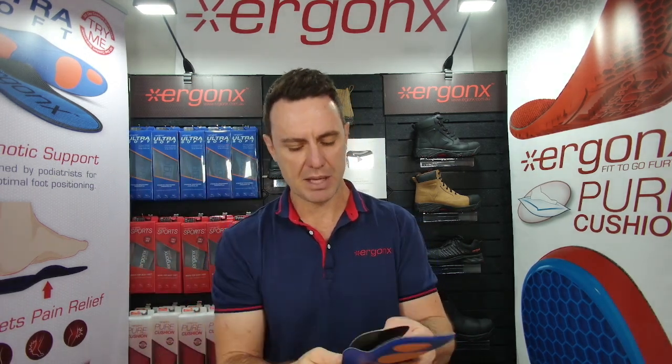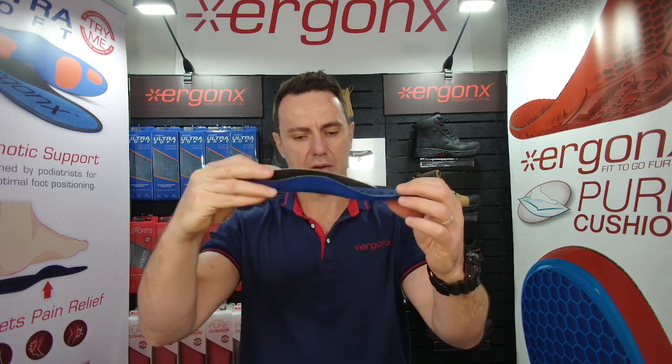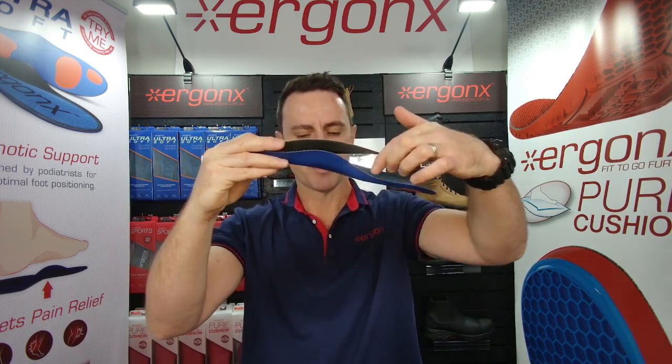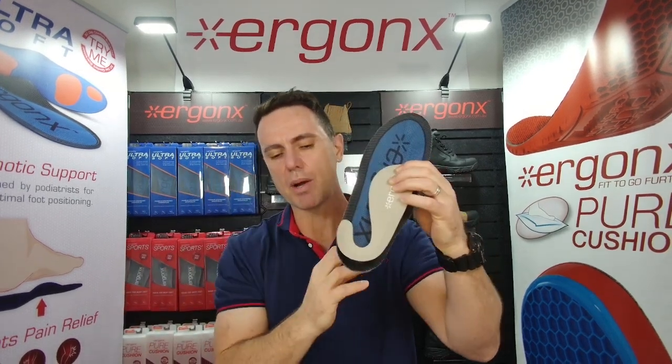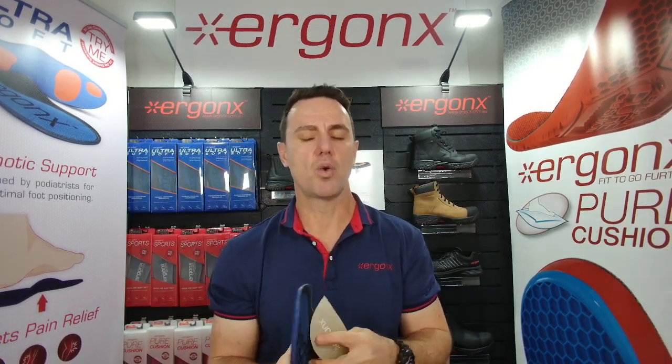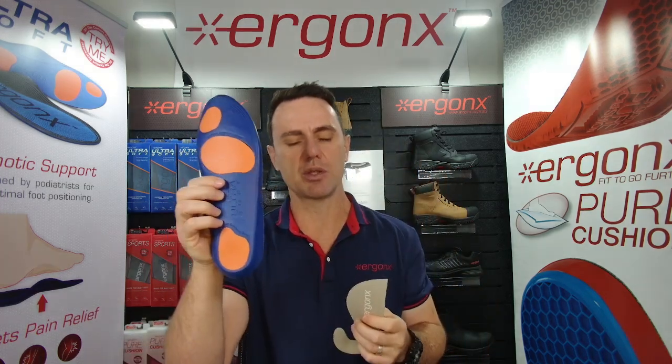If you compare these two orthotic insoles, they both have an arch support. But if you look at the Slimline, it's had all these extra pieces cut away so it won't bulk up the shoe, and you can actually fit it into quite a lot more shoes than the full-length orthotic insole.